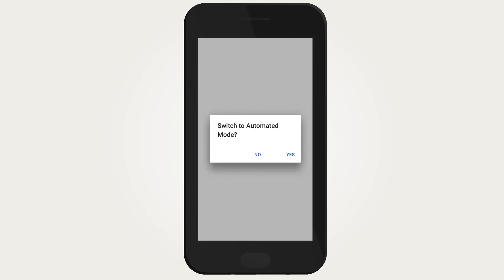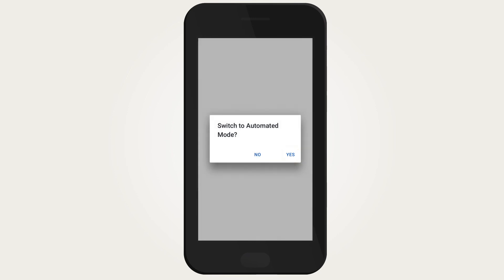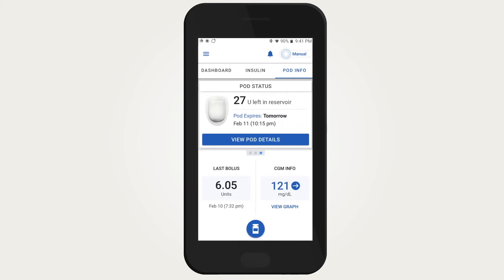If you have a Dexcom transmitter serial number already entered into the Omnipod 5 app, you can switch to automated mode by tapping 'Yes.' Otherwise, you will be able to switch to automated mode later once you enter your Dexcom transmitter serial number.